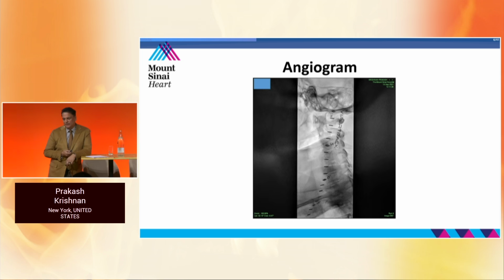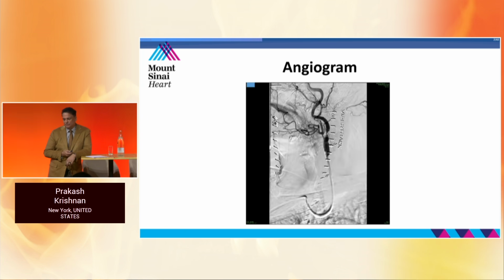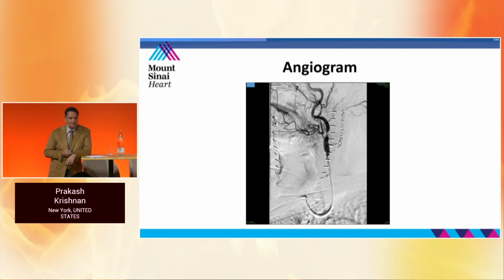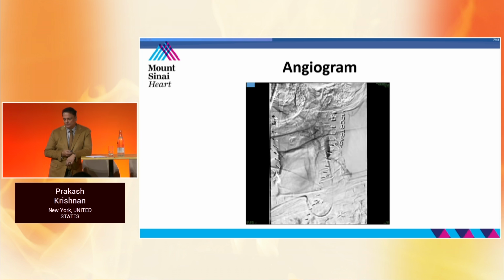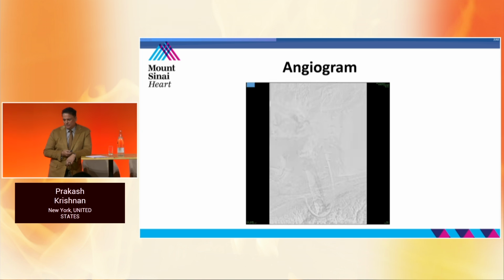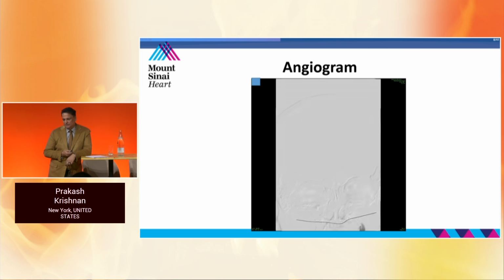And then we went ahead, and obviously this is the picture of the catheter. Then we went ahead and did a diagnostic angiogram, and you can already see, for those of you who can see, there's a little bit of an issue going on at the beginning of the sheath. However, we noticed this and we said, okay, let's just move on at this stage since we already have started the procedure. So the patient remained asymptomatic at this time, so we went ahead and did a diagnostic shot.